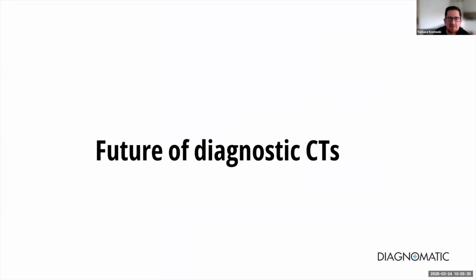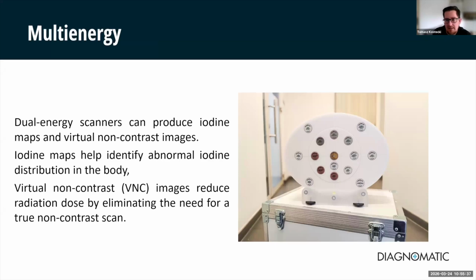Future of the diagnostic CTs. As CT evolves from anatomical imaging to material characterization, quality assurance must also evolve. This is where multi-energy phantoms become essential.